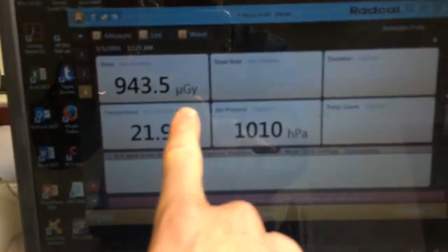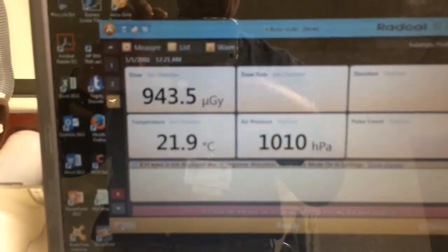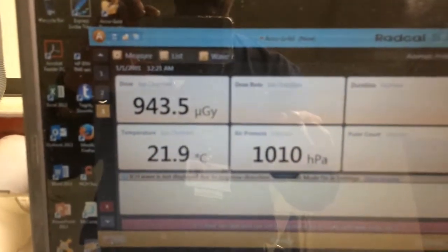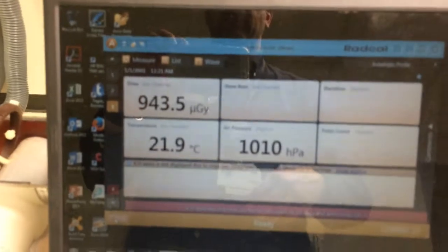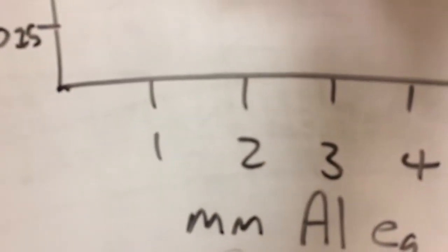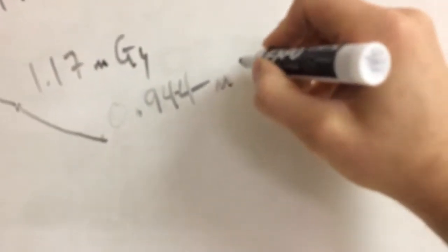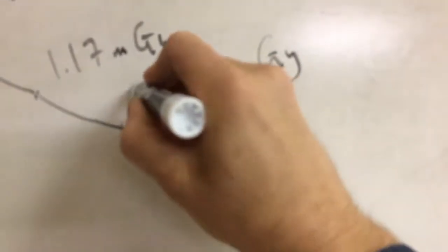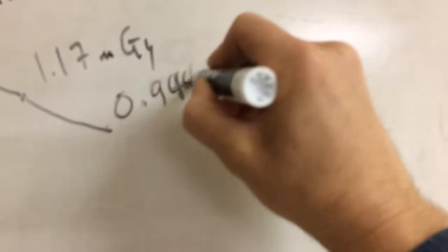That was 2 millimeters now. Now this machine, it changed the units to microgray, so we need to convert that to milligray. So it's 0.944 milligray. Again, it went down.